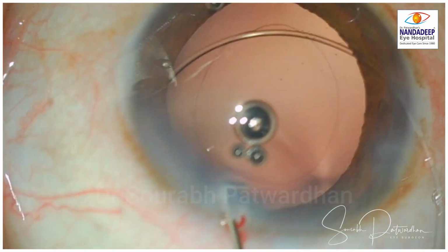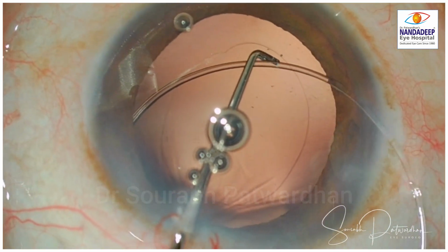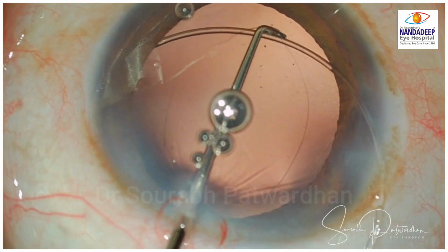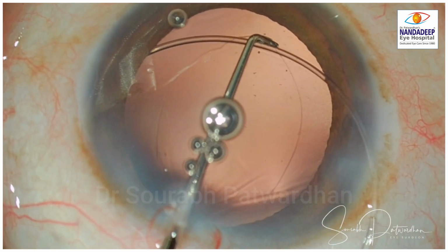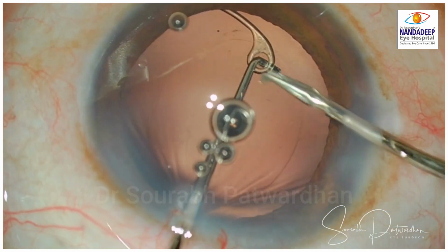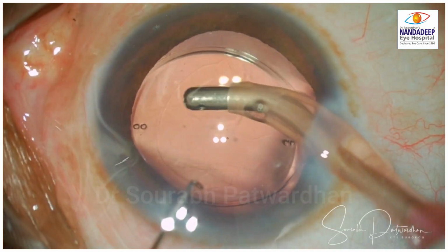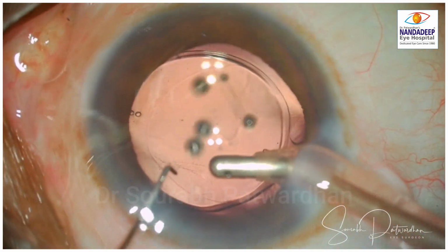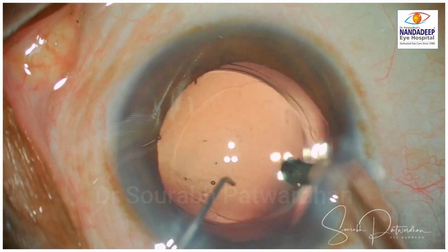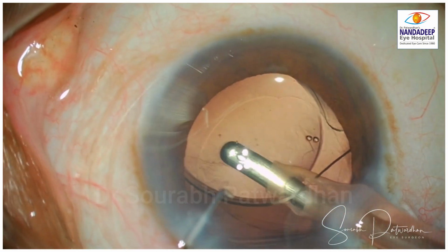So I am going ahead with insertion of the CTR. This is the technique that I follow. I use the left hand Sinskey to make sure that the CTR goes into the bag, and then I use the microcapsulorhexis forceps to push this CTR into the bag. Once the CTR is in place, the bag is very stable and I can implant the pre-planned toric IOL in this case without any issue of bag stability.